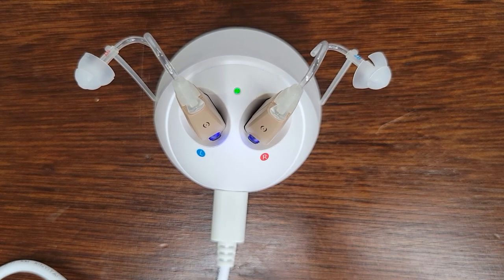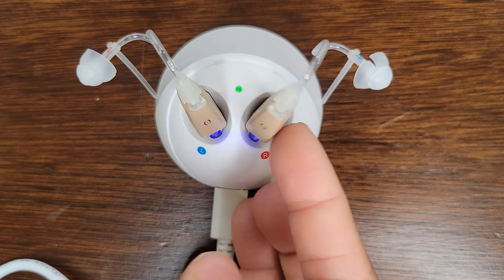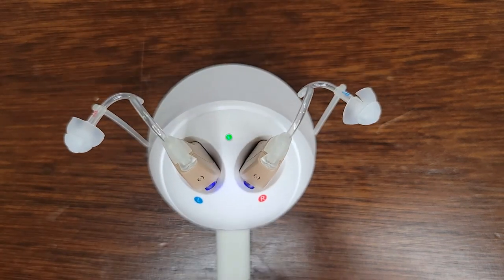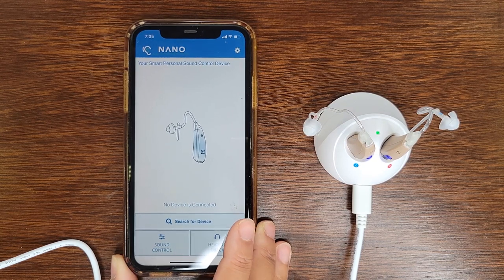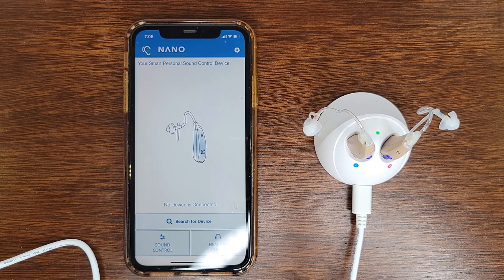This is our device charging. So when it's charging, the LED light in between the rocker switches would be blue. And when they're done charging, it'll glow green. So let's connect our hearing aids to the Nano Hearing app. You can download it from the App Store or the Play Store, and give your app Bluetooth permissions because it does need it to connect to your hearing aids.